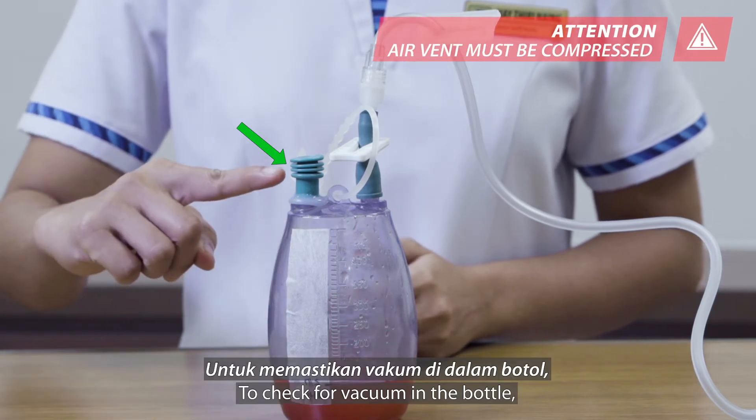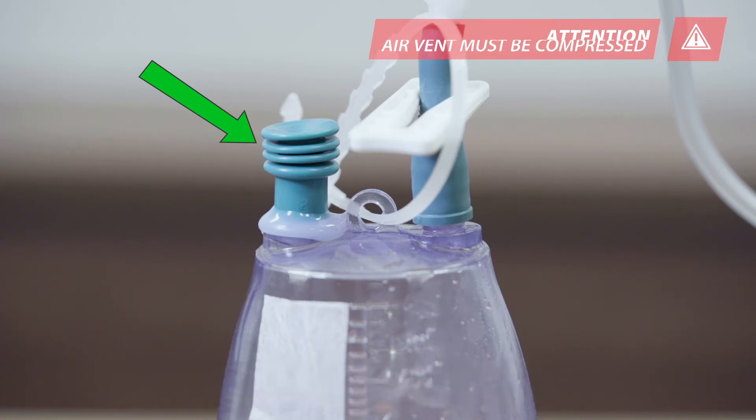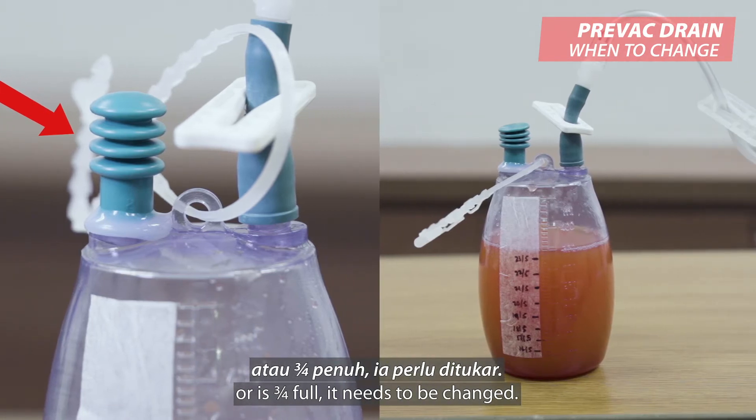To check for vacuum in the bottle, the air vent must be compressed like this. When the bottle has lost its vacuum or is three-quarters full, it needs to be changed.